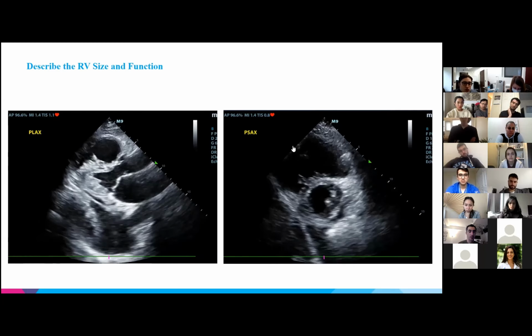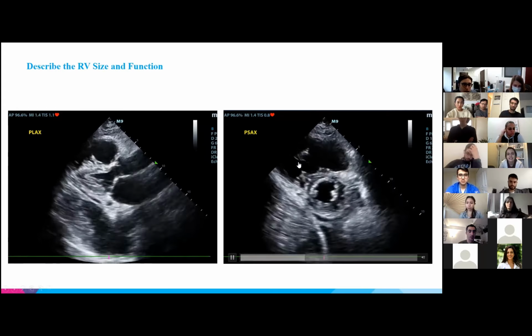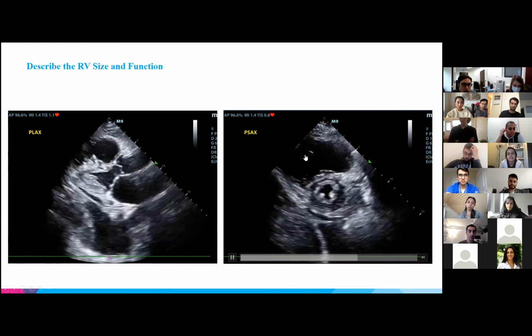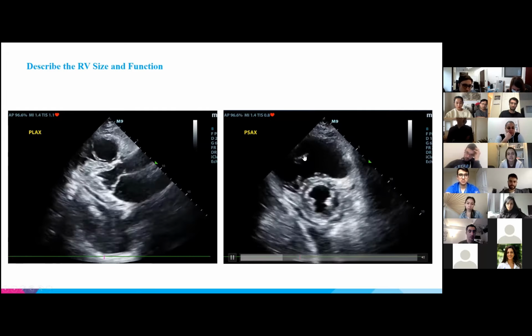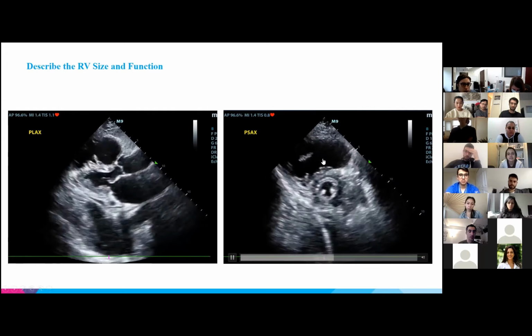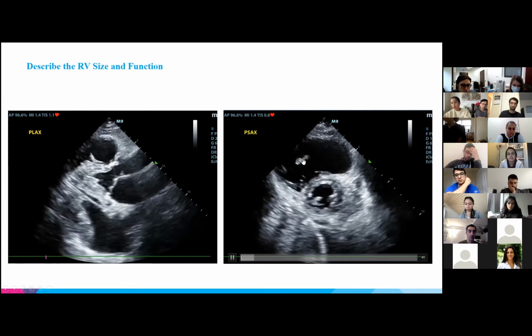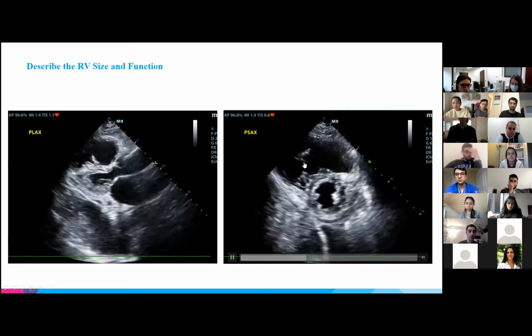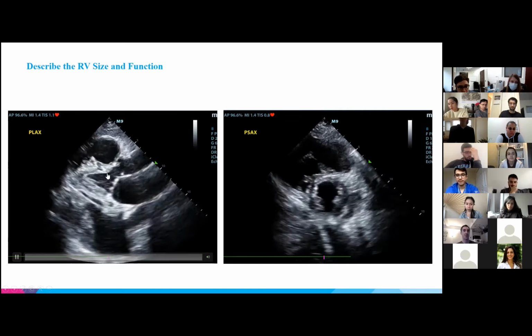Yeah, so I do think there is stuff floating around in here that looks concerning, but sometimes you get other aspects of the wall that's moving inward. So it's probably not a thrombus, but we'd have to see. If it were thrombus, it would usually be very mobile and moving much more, whereas this comes in, I think, with the wall. But certainly, this is your parasternal long axis.